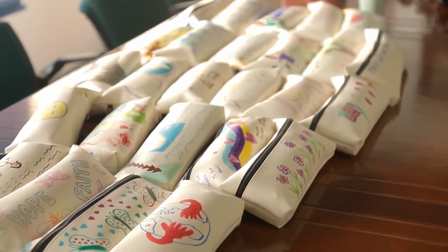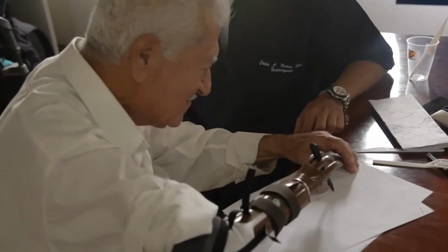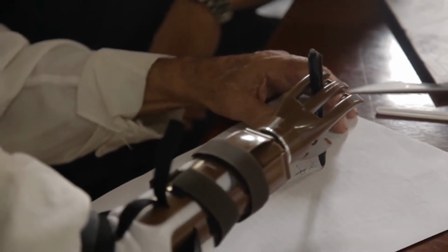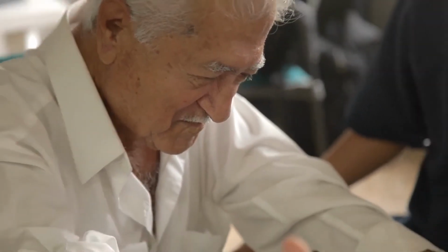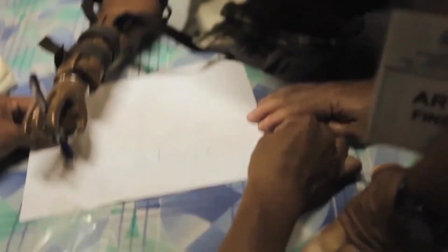So I'm going to tell you a few things about the hand at this point. There's a strap on here that straps on just above the elbow right here. We have two little bones, and the strap goes just above those bones, and then it runs down along the arm, and the hand actually goes onto what, in polite terminology, we call the residual limb. And that concludes my portion of the presentation at this time.